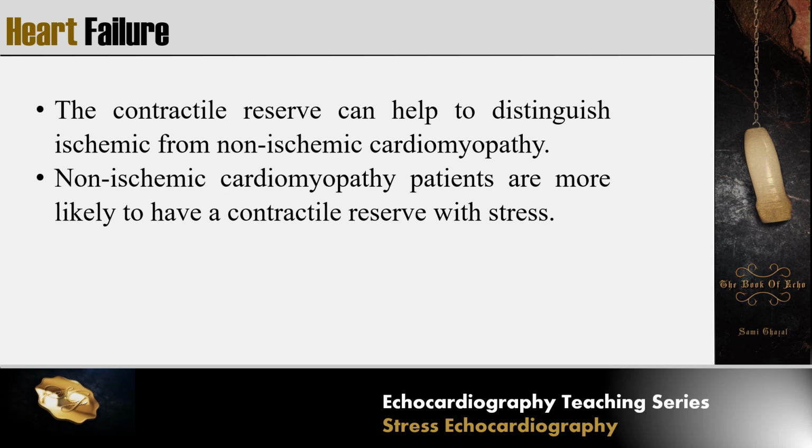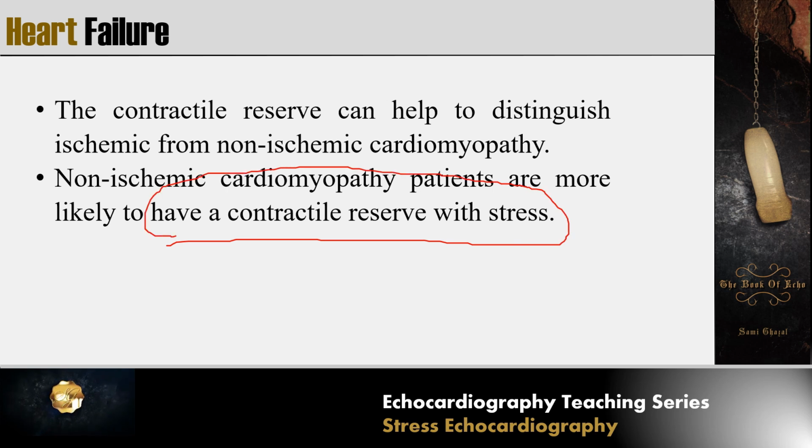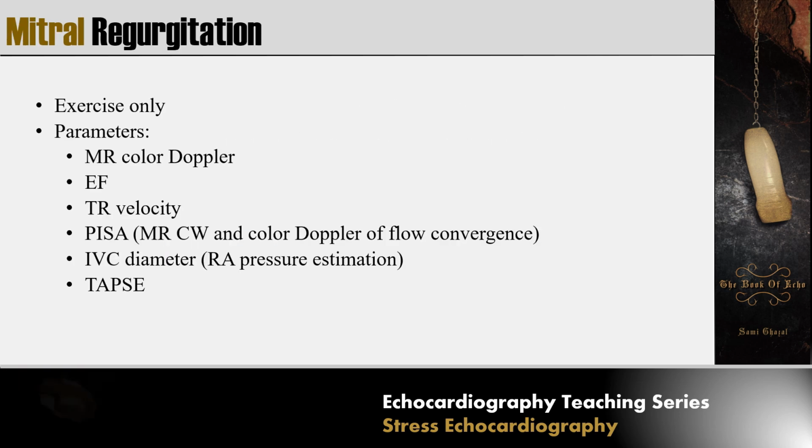Now, contractile reserve can help to distinguish ischemic from non-ischemic cardiomyopathy. Non-ischemic cardiomyopathy is more likely to have contractile reserve with stress. However, if it is ischemia or secondary to ischemia, you don't expect improvement with stress, and instead it might worsen.